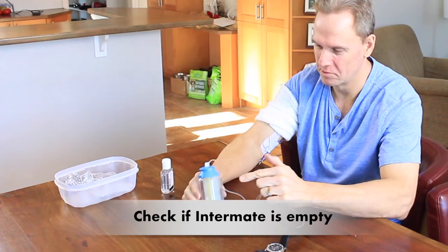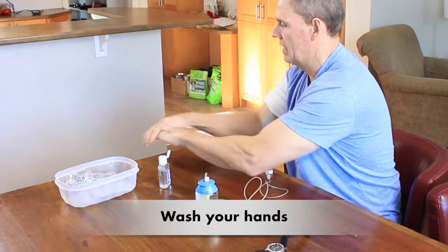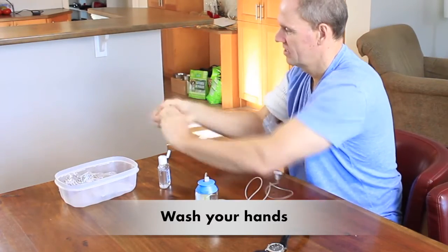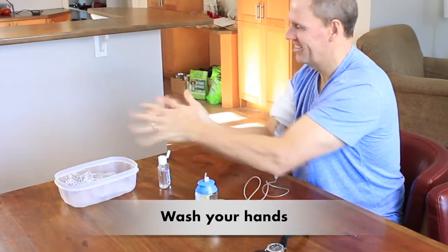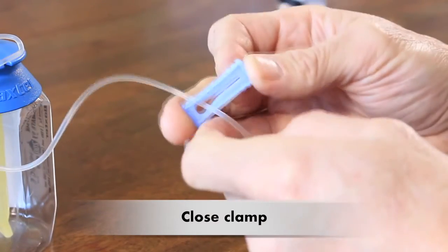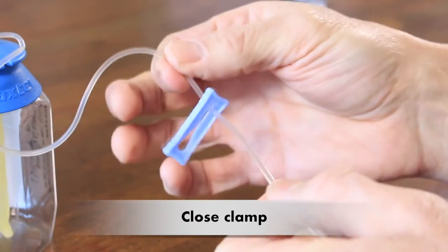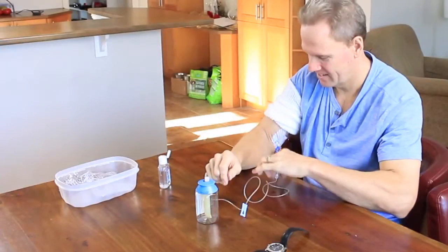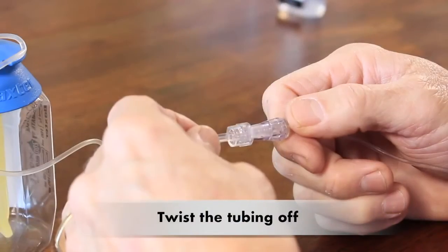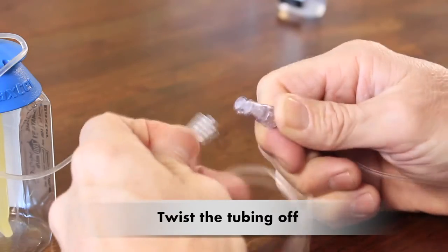So you need to again wash your hands as you were shown. Remember, keep it clean. You need to slide that clamp closed so that it is pinching the tubing and stops any fluid from flowing. Now hold your IV cap in one hand and the end of the tubing in the other. Now twist that tubing off and set the pump aside.